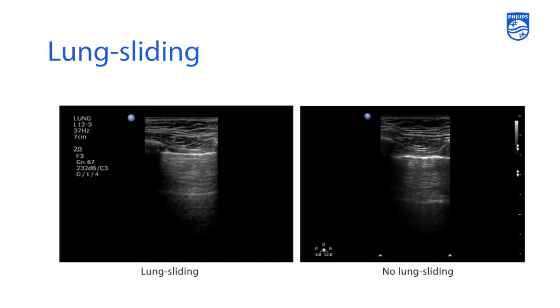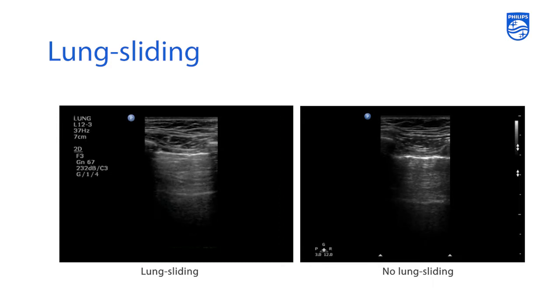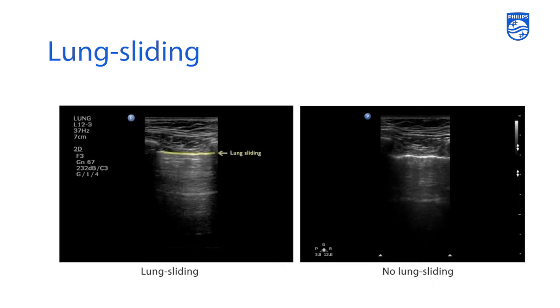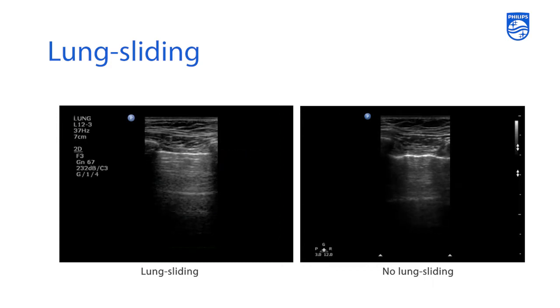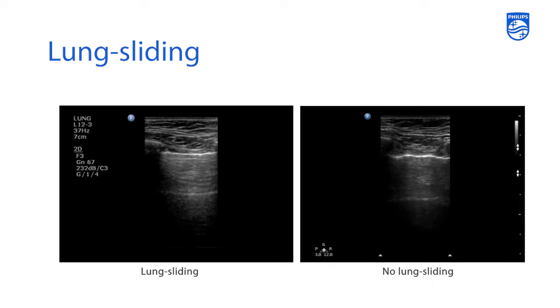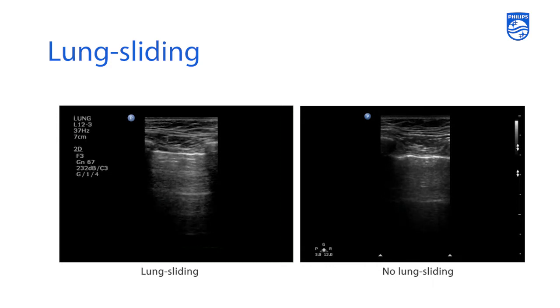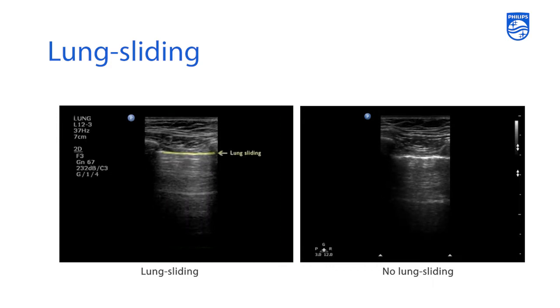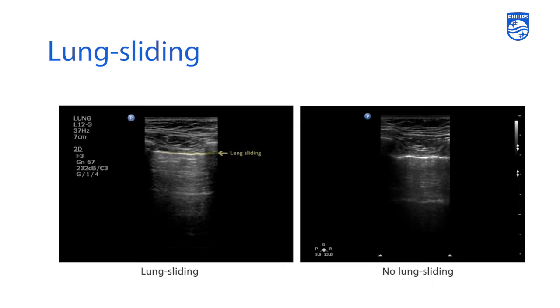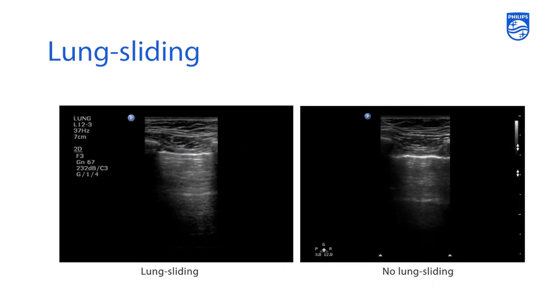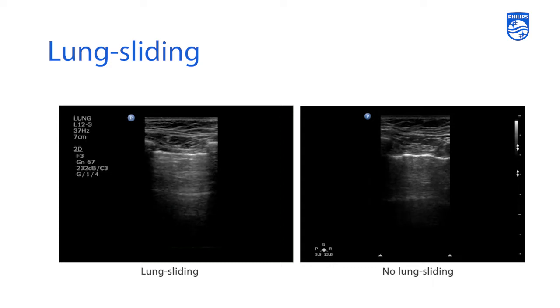If you did have this sort of image on your lung ultrasound, you would then go on to further evaluate it by putting M-mode on that bright white pleural line to see if there is actually a to-and-fro motion that you might be missing on your 2D assessment.